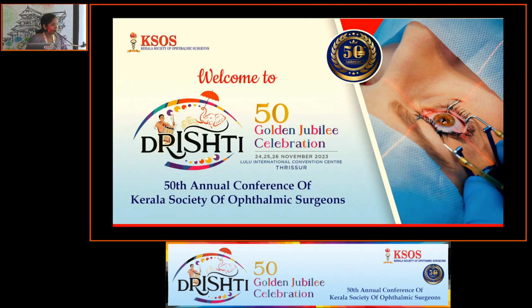Good presentation and good study. Did you do VEP also or only ERG? VEP only in indicated cases, like when we did a dilated fundus examination on those patients who showed optic disc pallor. Okay. So otherwise, where do you expect the damage in vigabatrin? Vigabatrin actually causes damage at the level of photoreceptors and bipolar cells. So that is the expected theory. The exact mechanism of damage is still not found out.